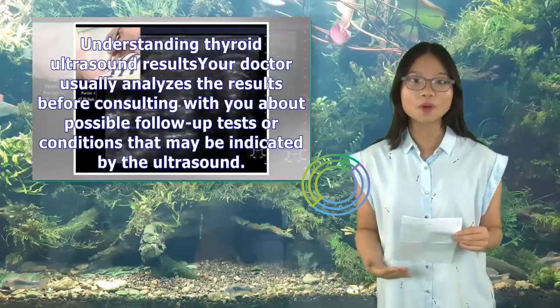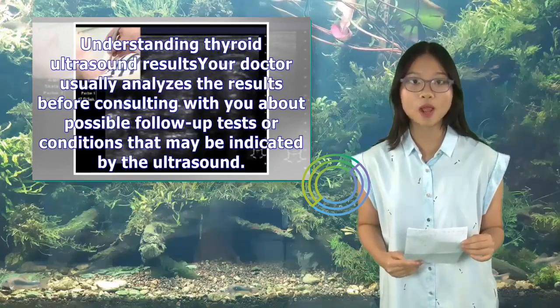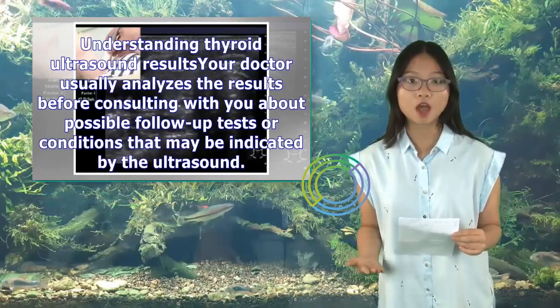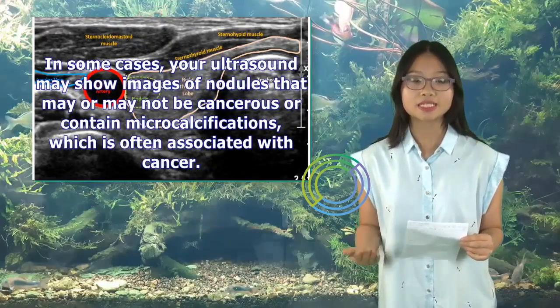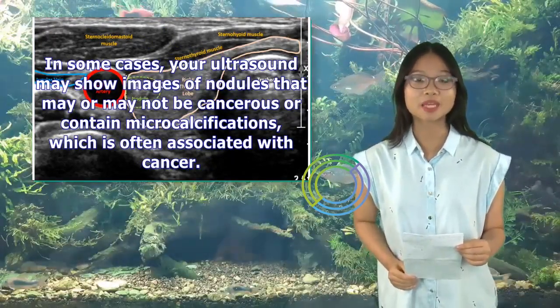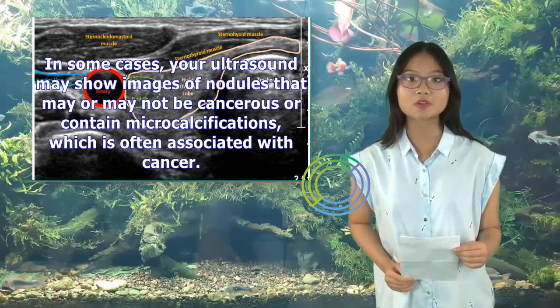Understanding thyroid ultrasound results: your doctor usually analyzes the results before consulting with you about possible follow-up tests or conditions that may be indicated by the ultrasound. In some cases, your ultrasound may show images of nodules that may or may not be cancerous or contain microcalcifications, which is often associated with cancer.